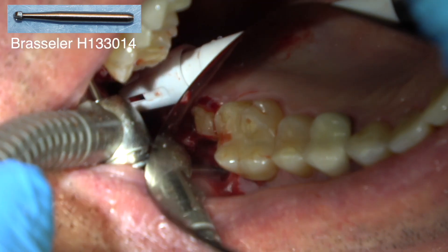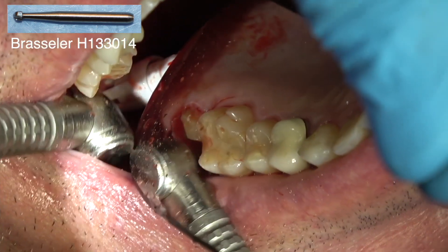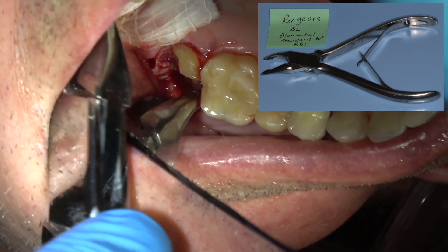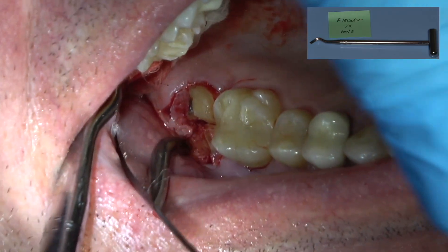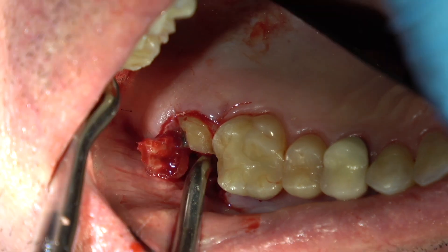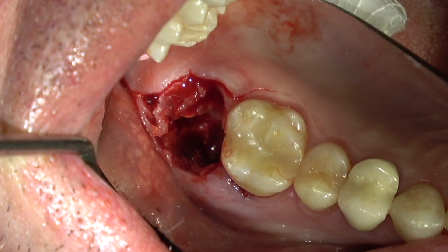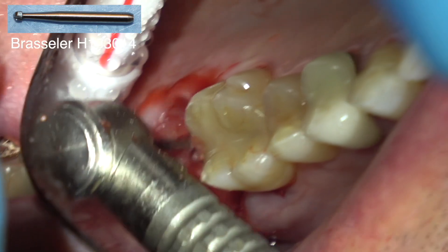Trying to rotate that mesial buccal root — these can be very tedious. This could be done in 15 minutes or it might take 30 or 45 minutes or an hour, depending on how things go. Just working, trying to get a purchase point to elevate that mesial buccal root. So I'm elevating between the palatal and the buccal roots and also in between the buccal roots — just trying to get a little luxation. And then once you do, you're going to unscrew the root, especially the palatal root. Once you get to the palatal root, you should be able to unscrew it just like you're unscrewing a maxillary central incisor — you just unscrew it, side to side. I've still got a buccal root tip remaining.